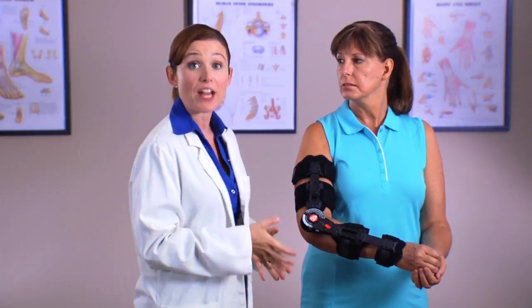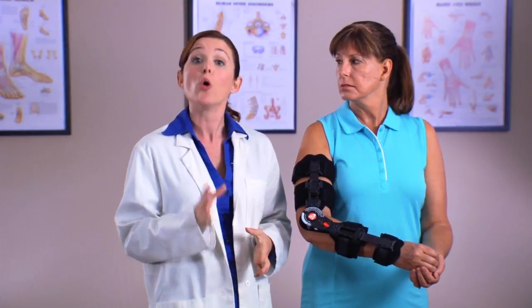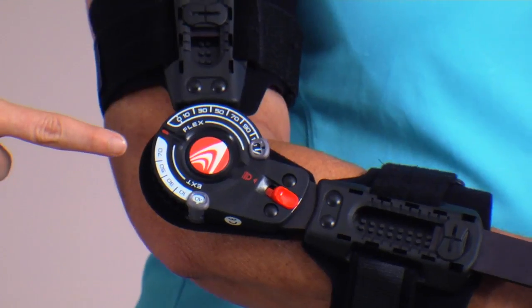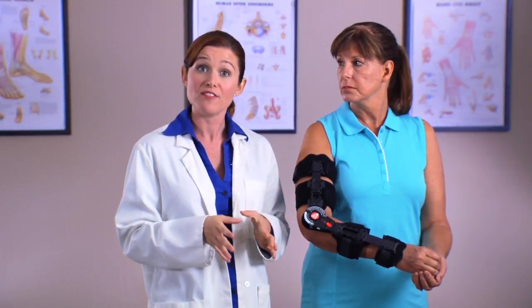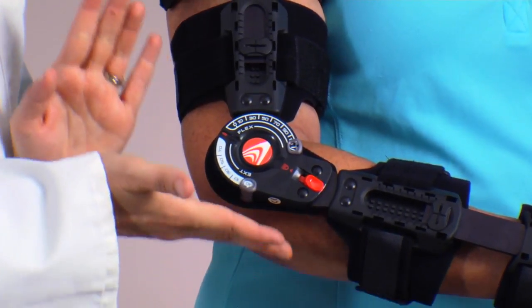Now, let's talk about the range of motion hinge. Only a medical professional should adjust or change range of motion hinge settings. The hinge on this brace is designed to limit and/or control range of motion. Patients should follow their physician's advice regarding activity level while wearing the brace. The spring-loaded tabs may be adjusted to limit the range of motion.